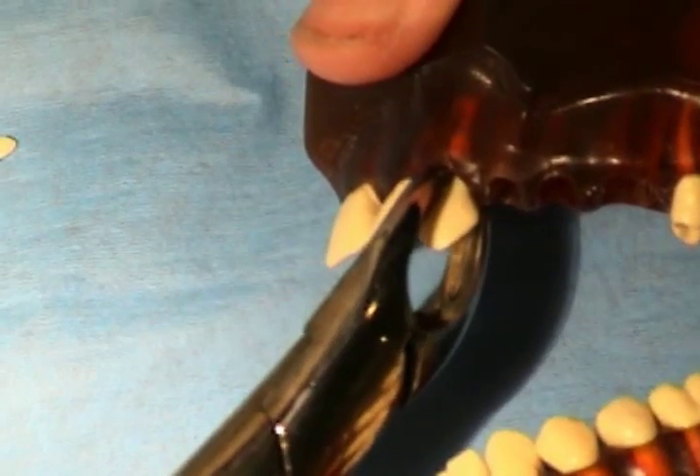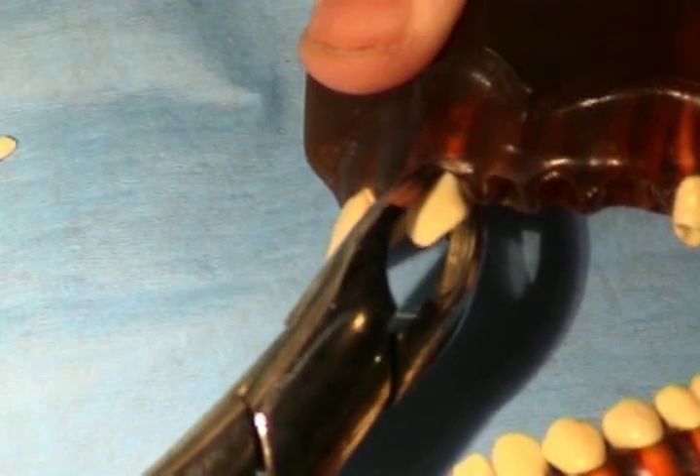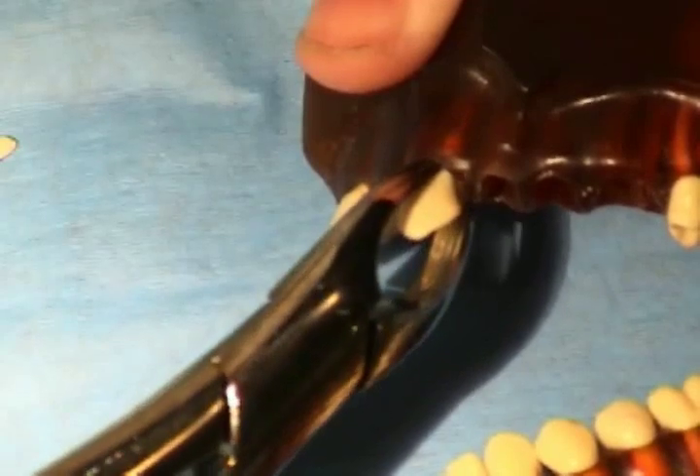When extracting teeth with one mostly circular root without deviations, such as the upper canines, it can be useful to apply a rotational force during the extraction.